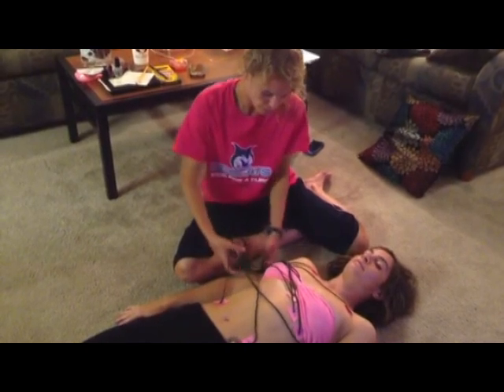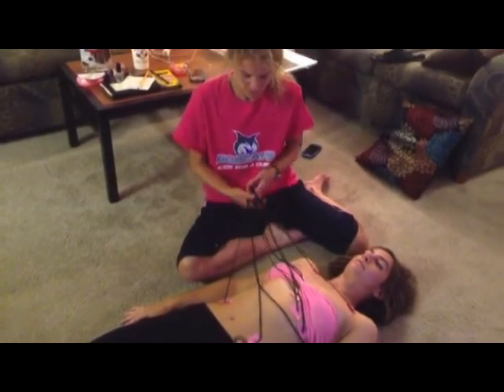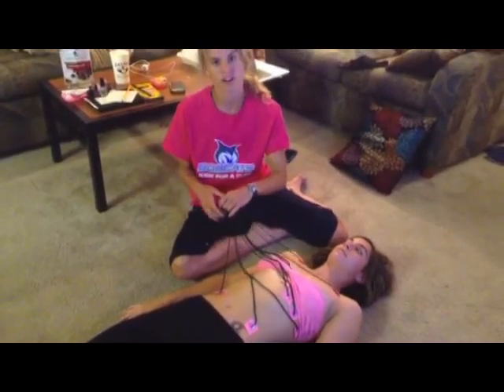And once you're finished, all the wires are hooked up to an EKG machine, which will give you your final recording.